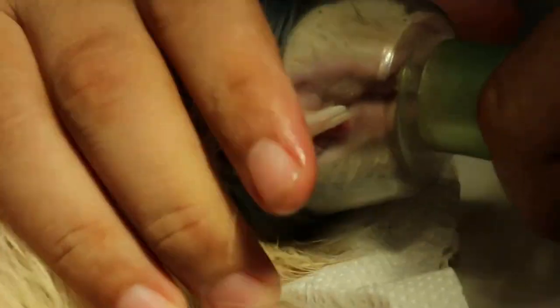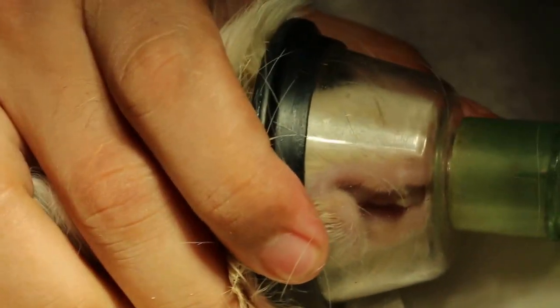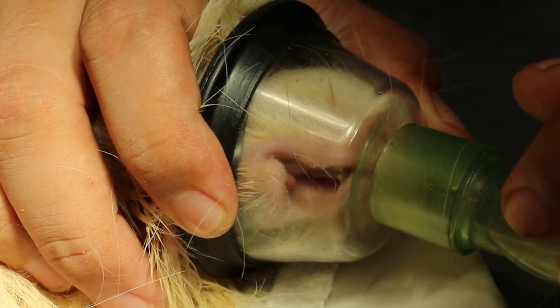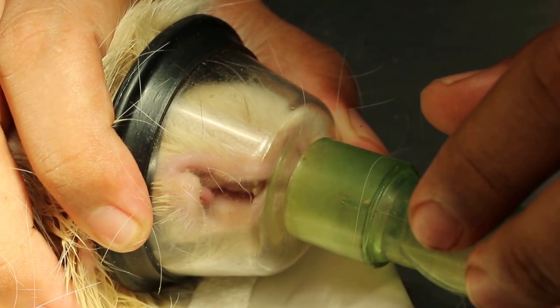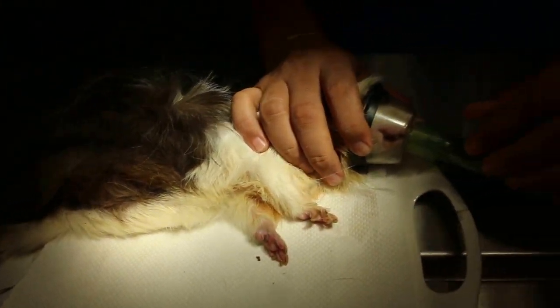Now we put back some anesthetic and then I will cut the molar spur. The lesson here is that if you just cut the front teeth and never check the molars, then the guinea pig might not eat again, because it can't grind the pellets. For guinea pigs and rabbits, you have to check both — you cannot check one only. Although most of the time with rabbits, we just check the front.